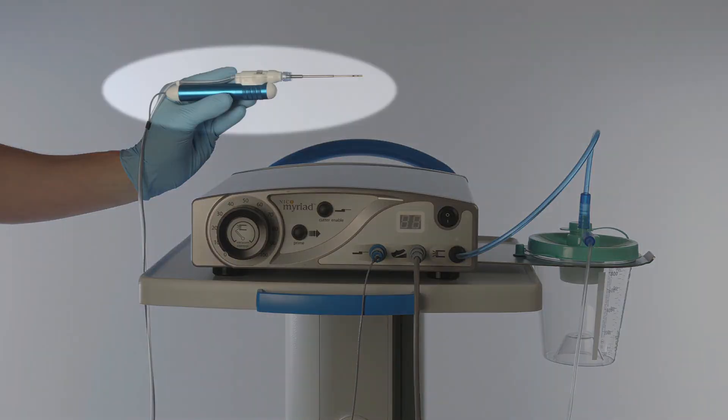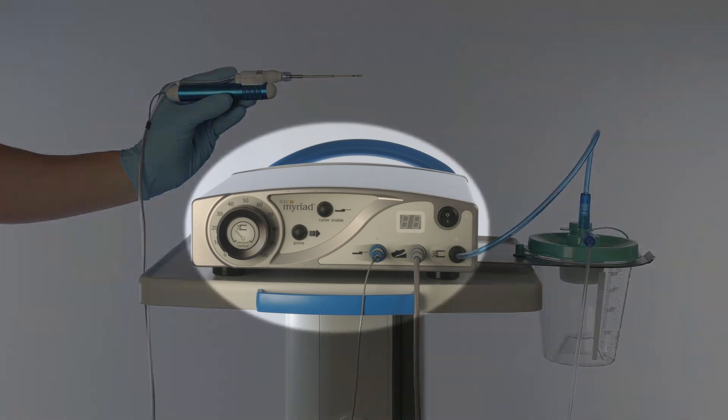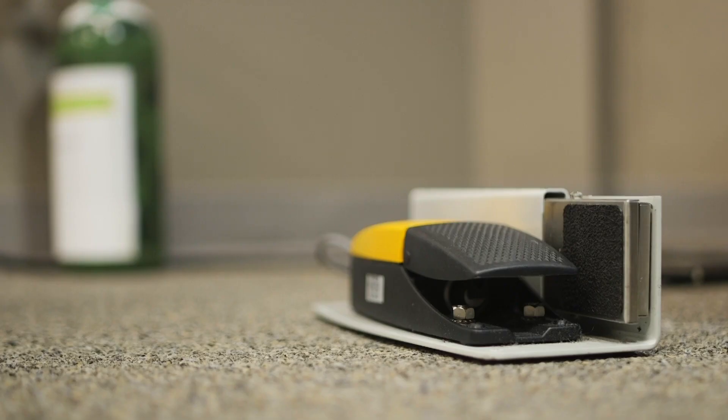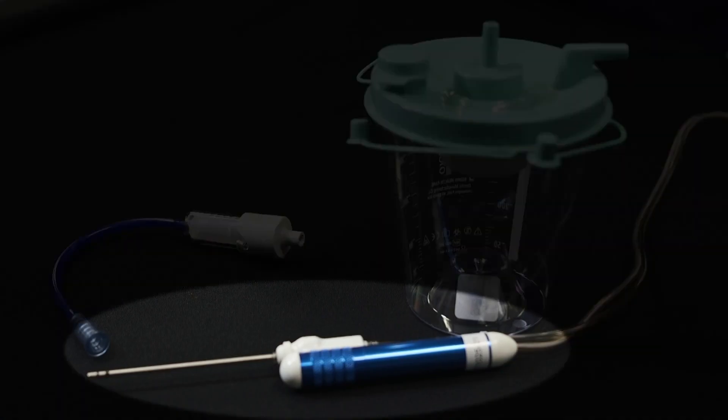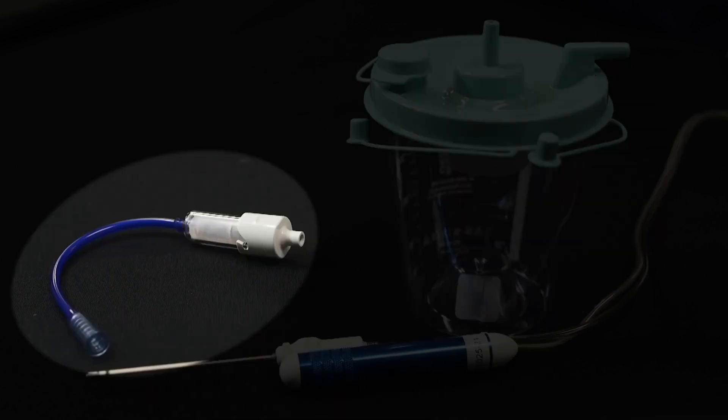Various handpiece sizes are available for these procedures. The Myriad consists of a console, foot pedal, and disposables, including the Myriad handpiece, 800cc Bemis canister, and specimen collector.